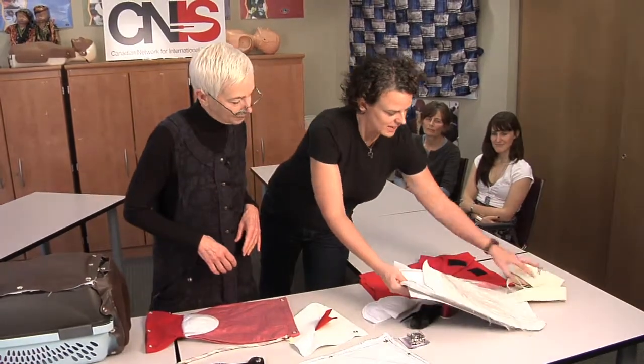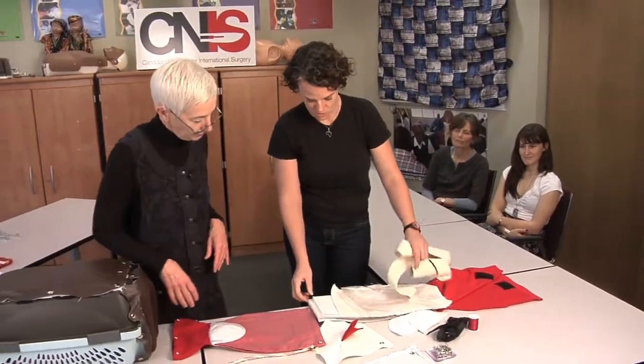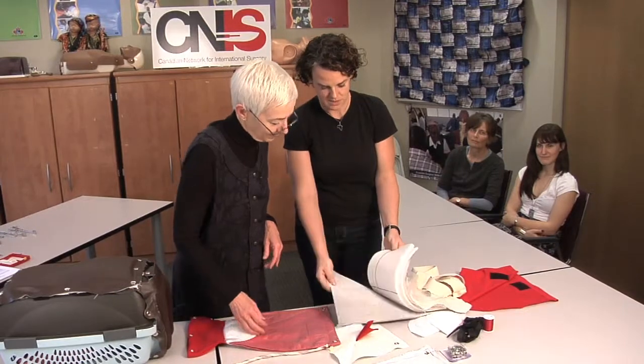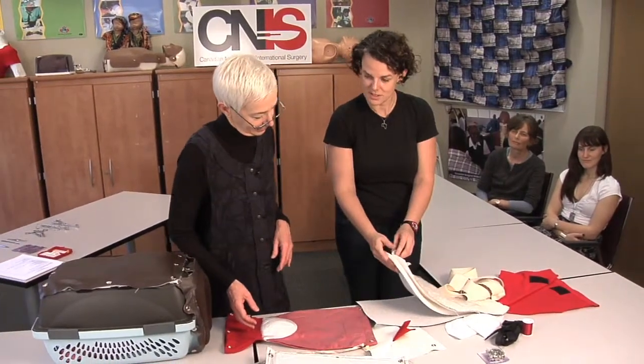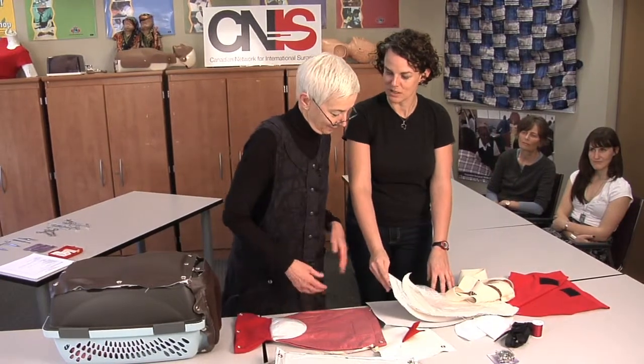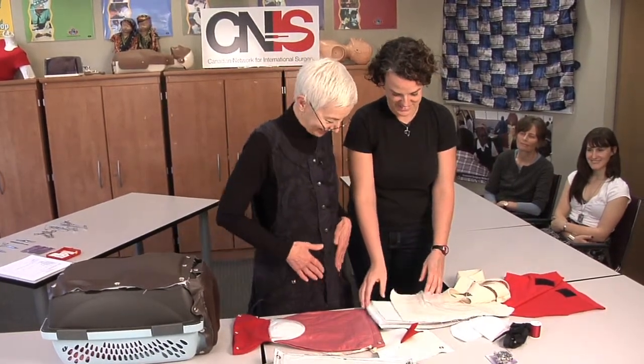The first thing that we make is an abdominal wall — a pretend abdominal wall that they use in this C-section box. Can you show me the parts that you put together? These are the layers we use to make the abdominal wall: a layer of vinyl for the top — the skin — and then these simulate the fat, the fatty layer.